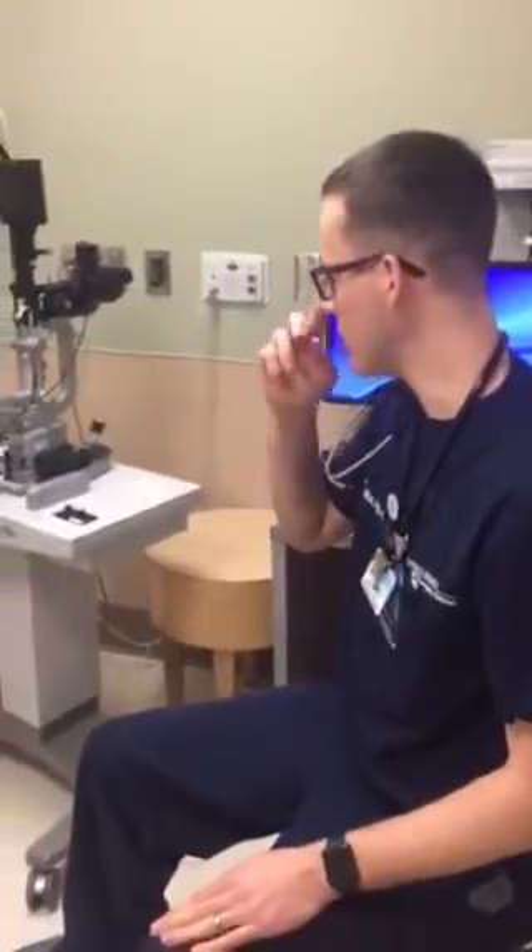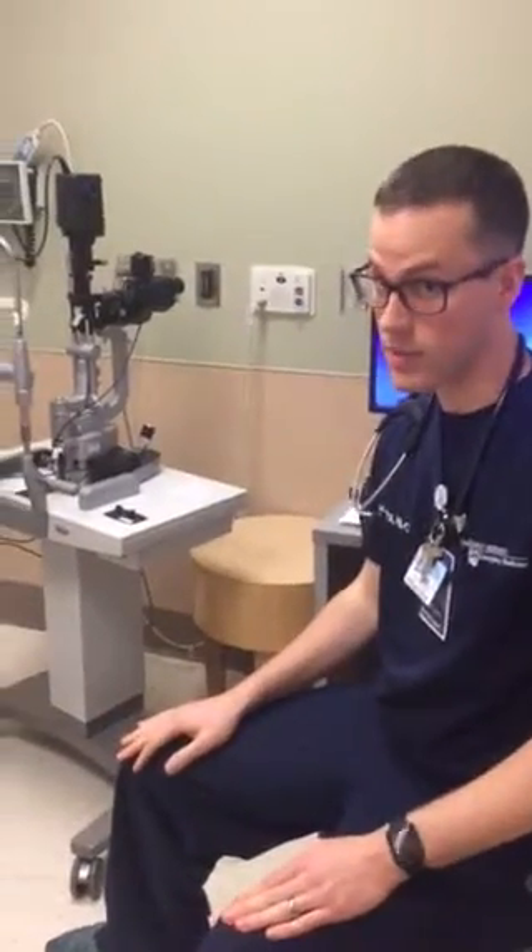We're going to do a slit lamp 101 course — a step-by-step process of how to use the slit lamp and do a slit lamp examination. There are a lot of controls to the slit lamp and it can get a little confusing, so hopefully this video is helpful to people who haven't had experience with the slit lamp.